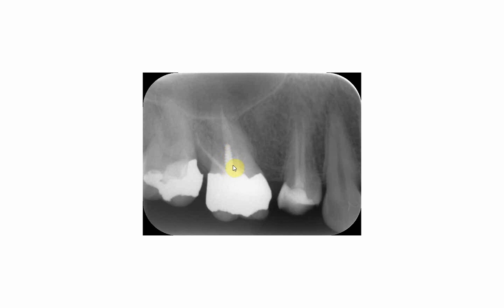See, these are the threads of the screw that has been threaded into the palatal root canal, which is usually the largest canal, so the screw retainer is threaded inside the palatal canal.